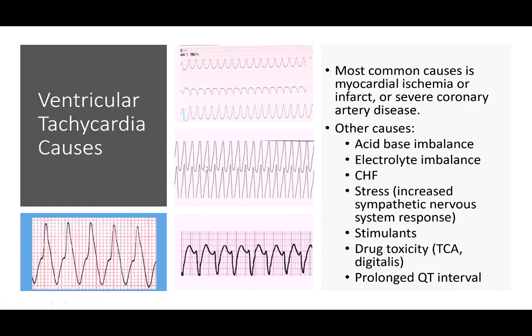And you can see it starts getting a little bit more narrow just because there's less time for that to produce. This patient, a little closer to like the 100s than the 200s. And you can see it's a little bit wider because we have more time for that to depolarize.